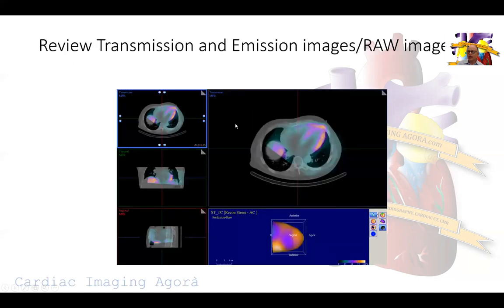Then we look at our center. We do SPECT-CT on all the stress images. Rest images we do with regular SPECT and we don't do CT attenuation correction. On the stress images we use the CT to get the maximum benefit and minimize radiation by avoiding a CT on the rest images.